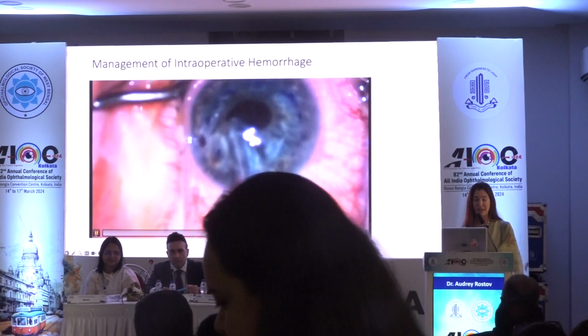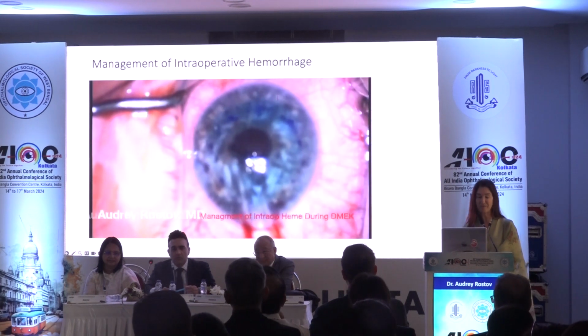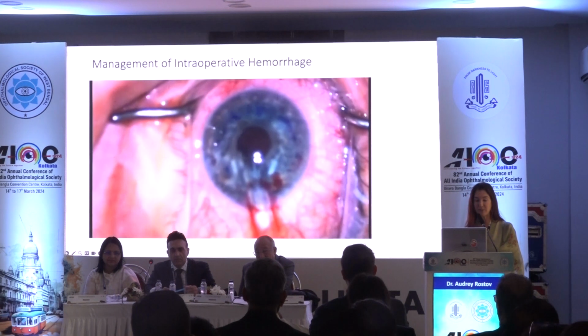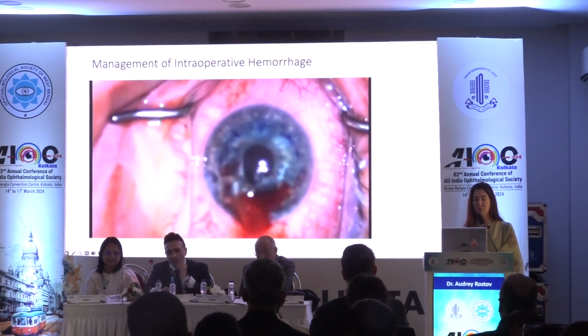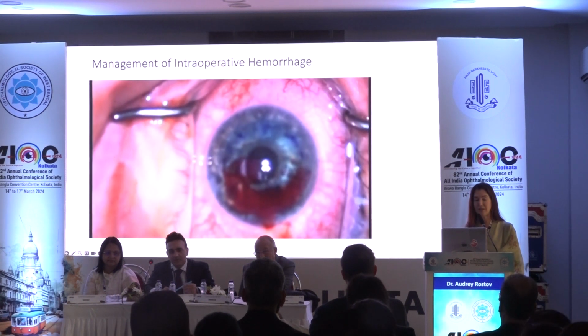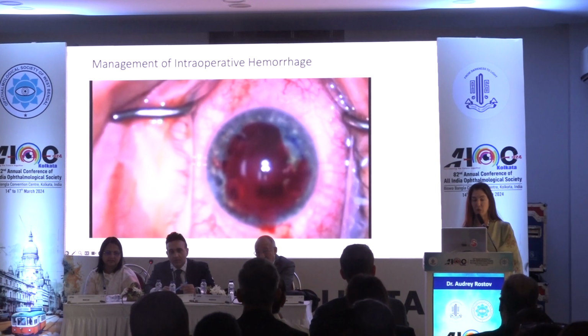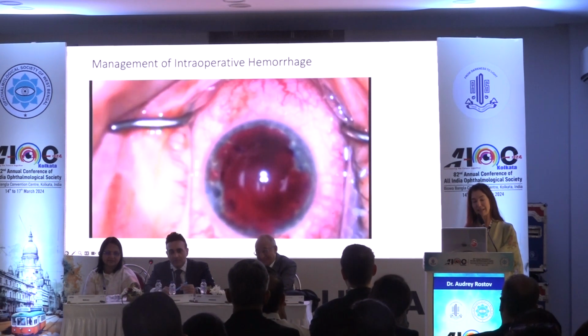What happens in this case, some of you have seen this video. I still get nightmares from it. In fact, it makes you feel a little sick. You might be sorry you had a large breakfast. I'm about to insert the DMEK graft, and oh my goodness, what happens here? Yeah, it's like a scary movie. I'm pretty sure I have hit the aorta at this point in time, and I have to irrigate out.